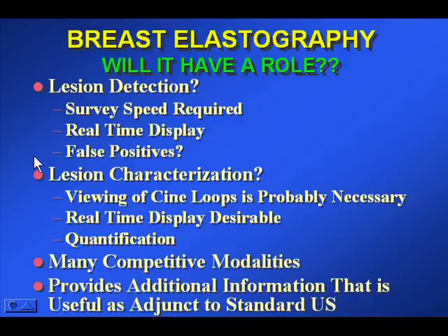So, to summarize breast elastography, will it have a role? Well, what about lesion detection? One problem with elasticity imaging is that on any given image you may see many or several dark areas which all could be cancers, so there may be a problem with false positives. Until recently, real-time display has not been possible, which limited its use as a screening tool.